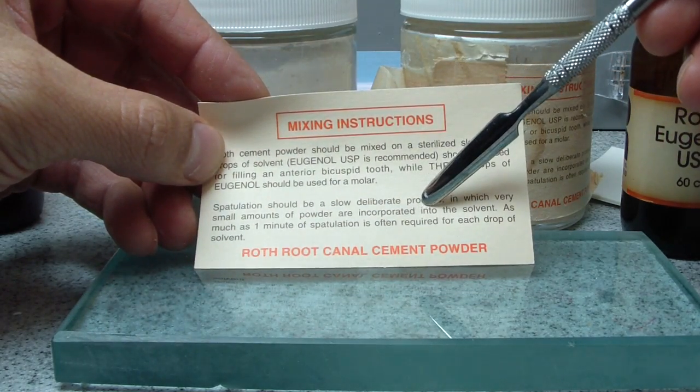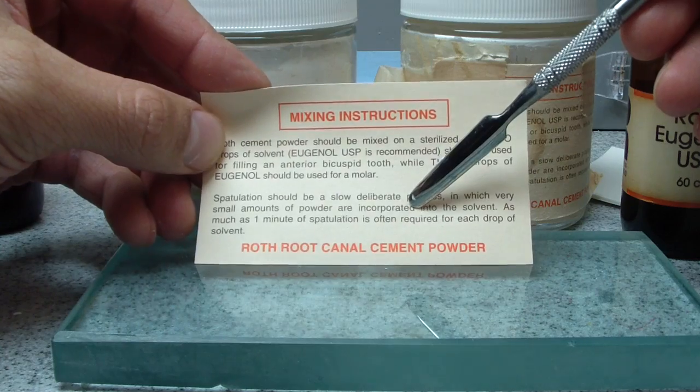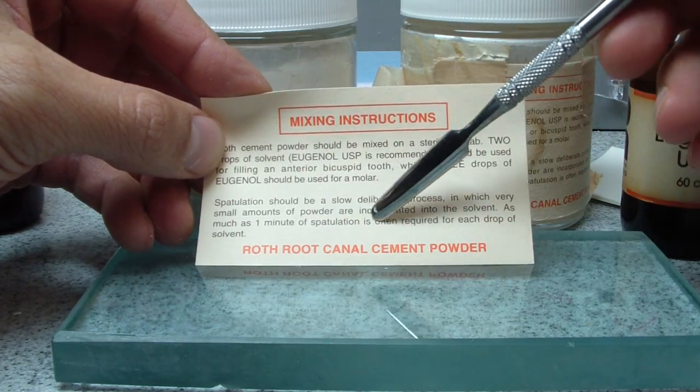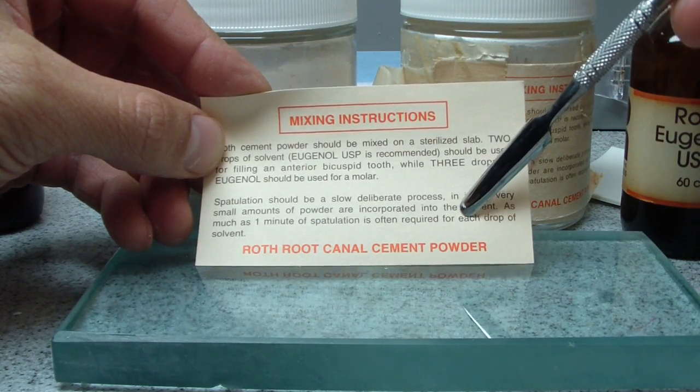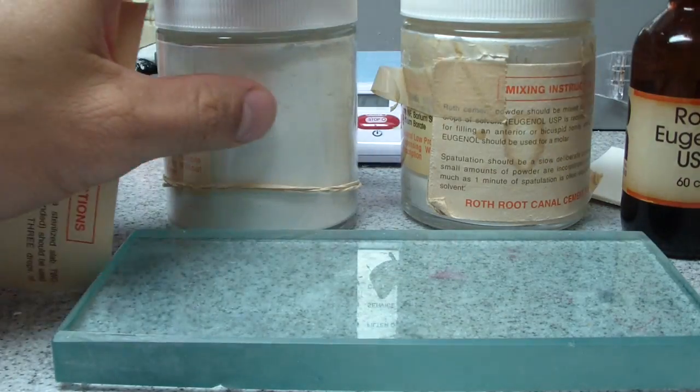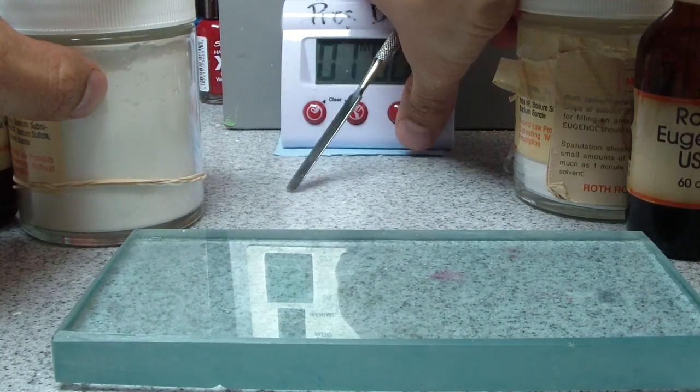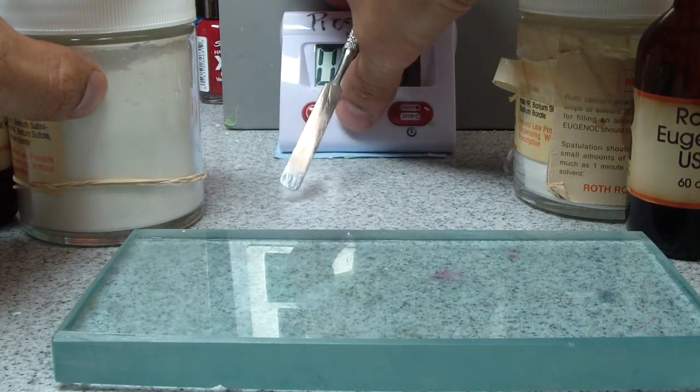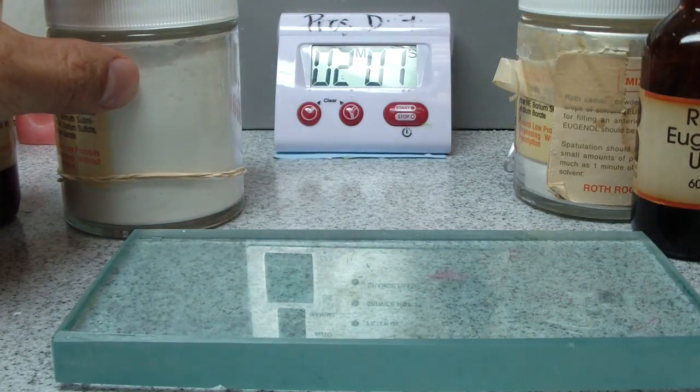But when this was developed, which was a long time ago, I'm going to make that assumption. Spatulation should be a slow, deliberate process in which very small amounts of powder incorporate into the solvent. As much as one minute of spatulation often required for each drop of solvent. So we're going to pretend we're doing a bicuspid, and I found the good old timer. So let's increase that to two minutes.